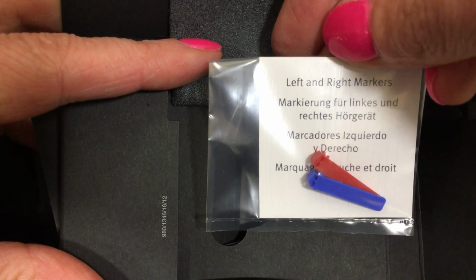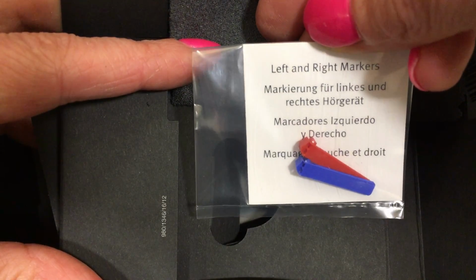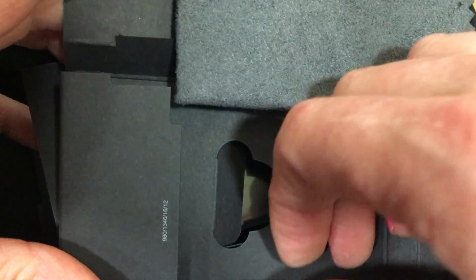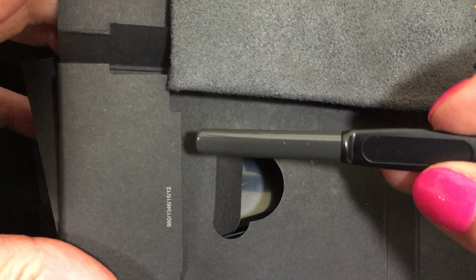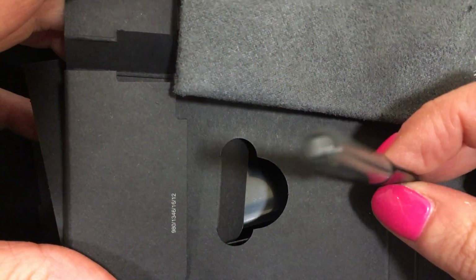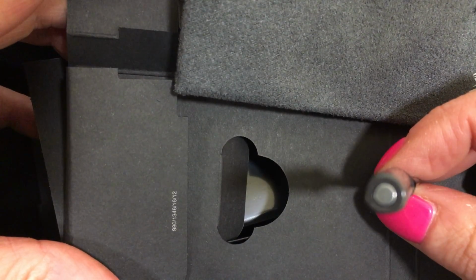Red indicating the right hearing aid, and left indicated by the blue. We also have in here their generic cleaning brush. It has a nice little magnet on the end to help pick up batteries.